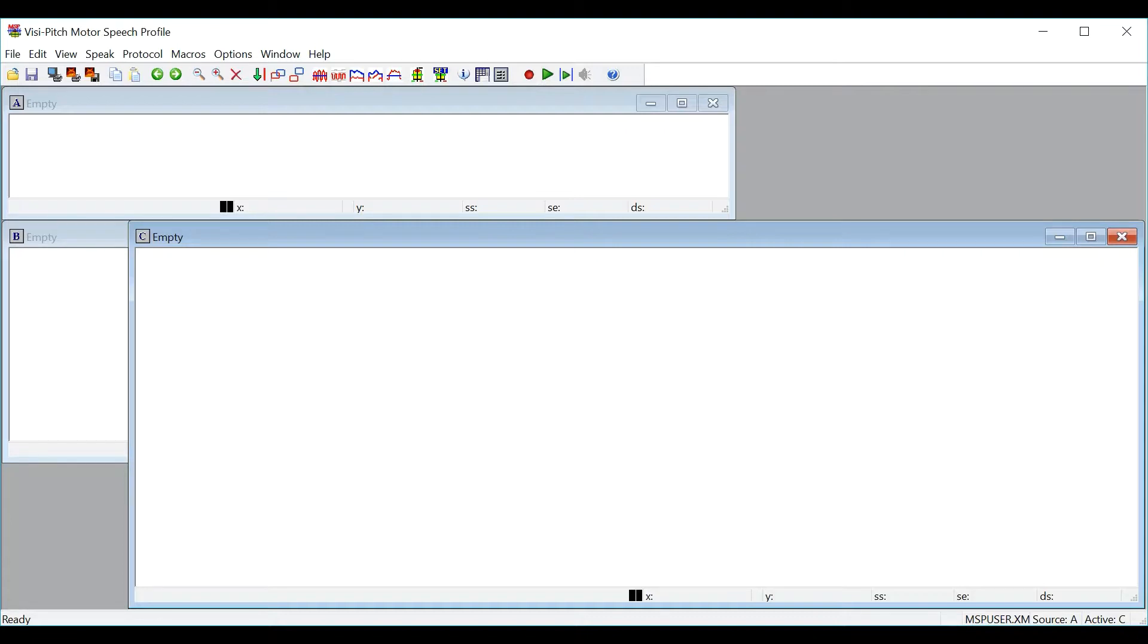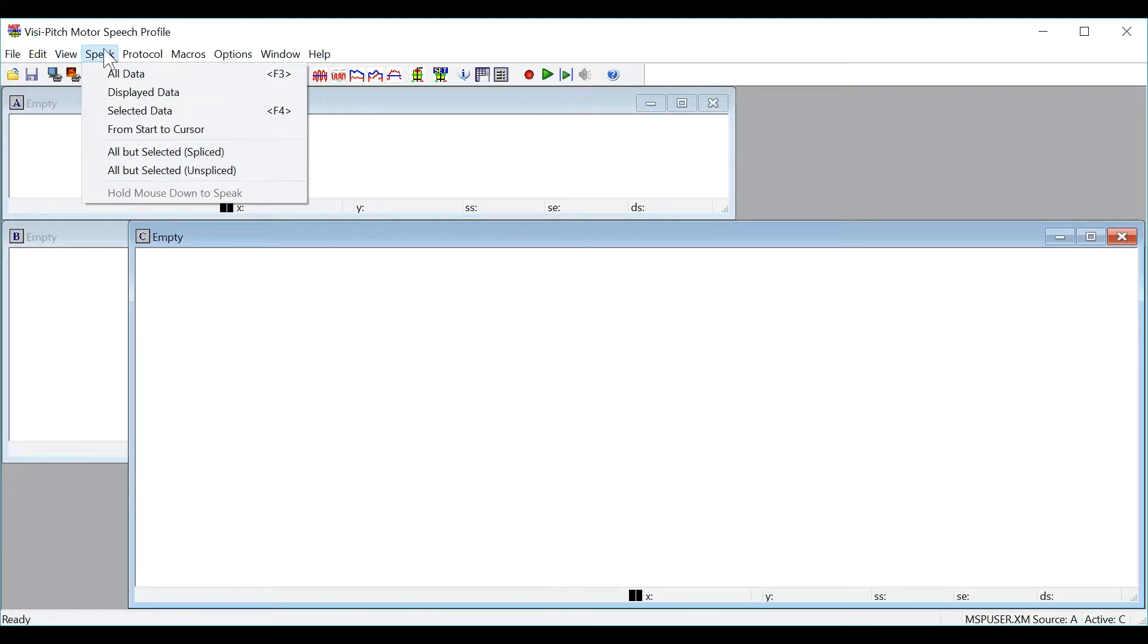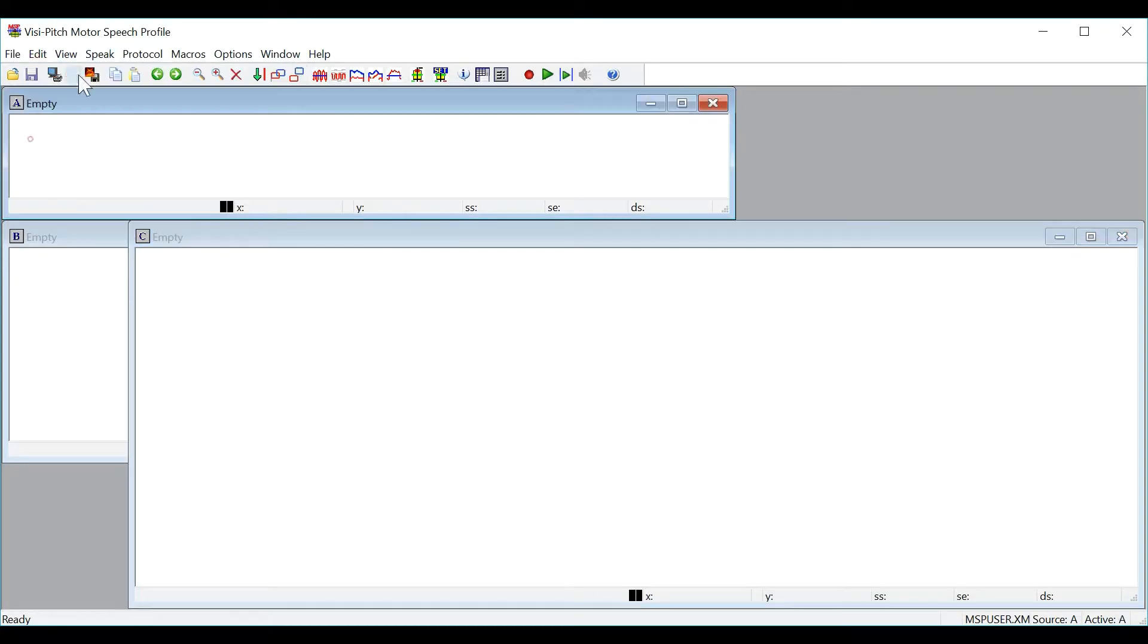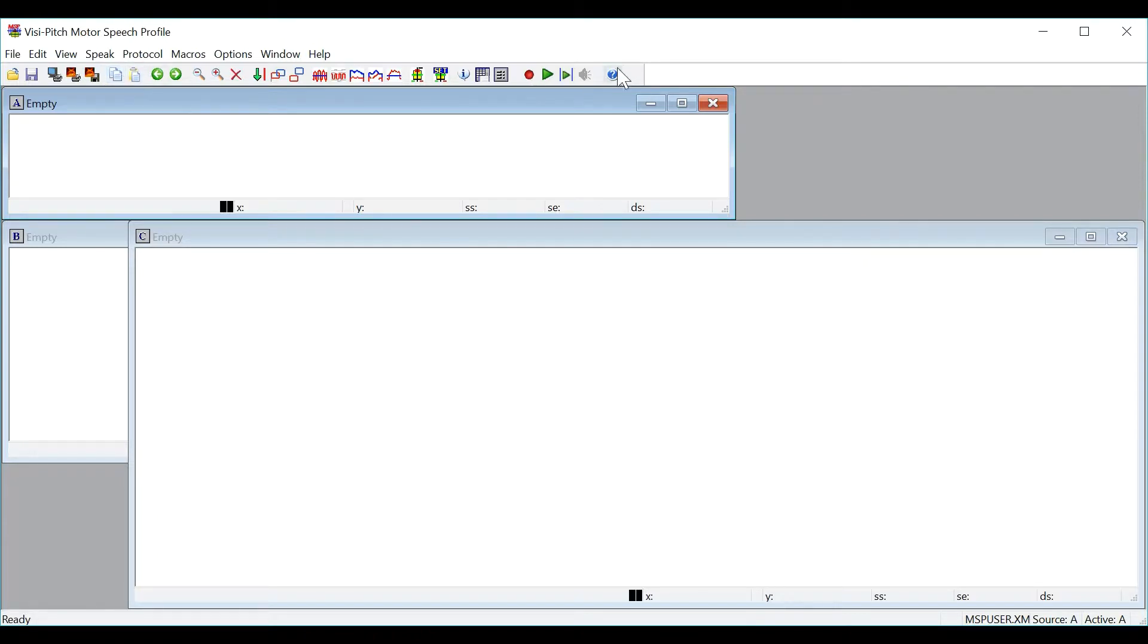When you first open the program, this is the window that you will see. At the top left you will have pull down menu buttons and directly below you will have the toolbar with many commonly used functions in the program. To review all of the functions of the toolbar, please click on the help menu to review the instructions for use.